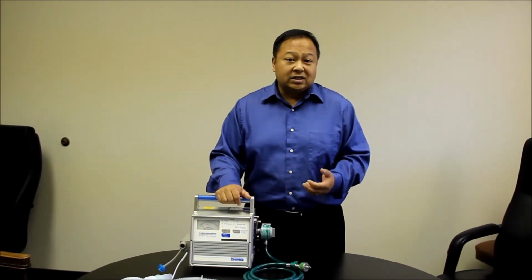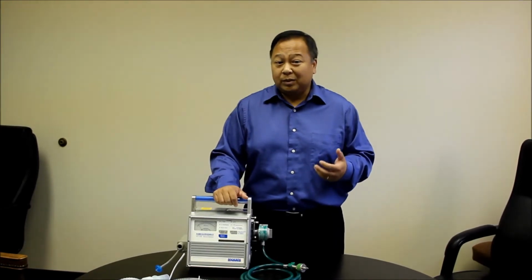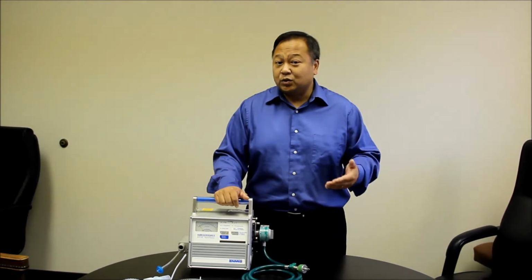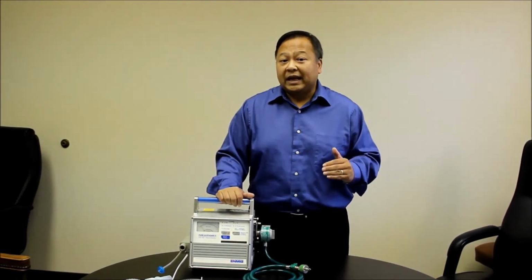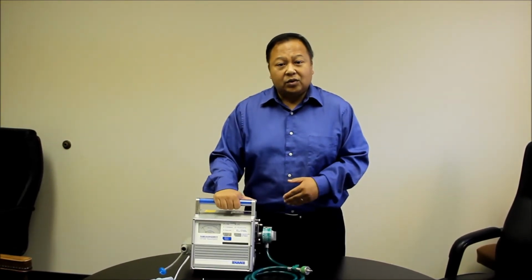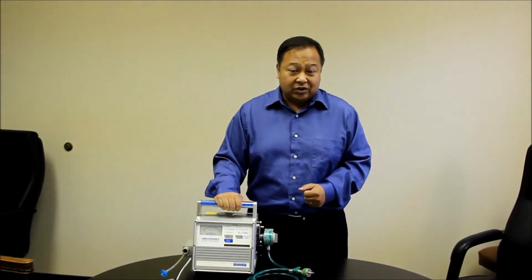The other aspect is, what happens if they're not ventilating? When we're talking about not being able to ventilate, this is an emergency, because your CO2 levels will increase, therefore causing your pH to go down. When that happens, you need to get the patient ventilated. So what I'm going to do today is describe to you the basics of mechanical ventilation.